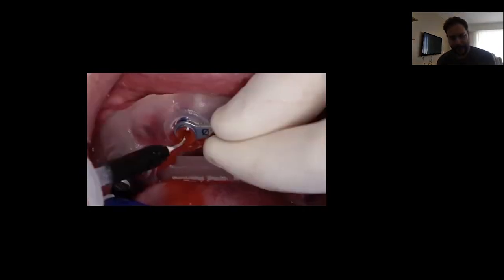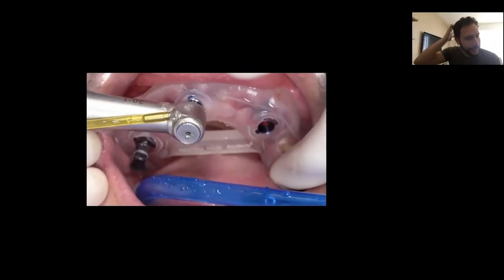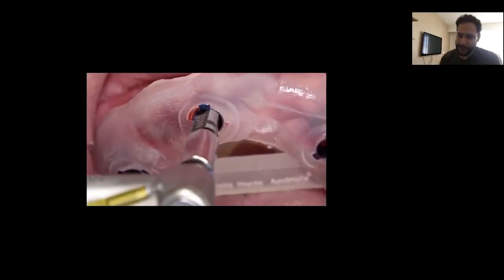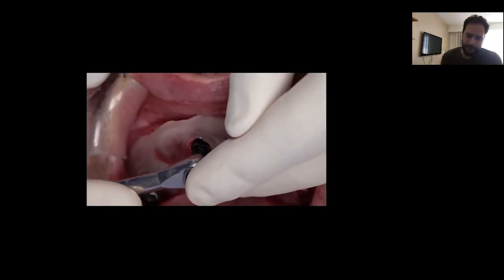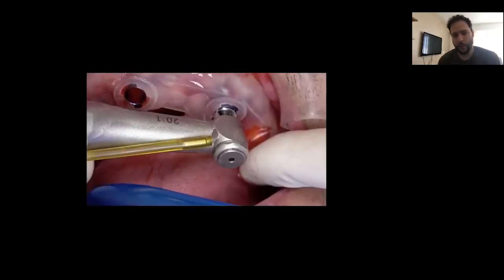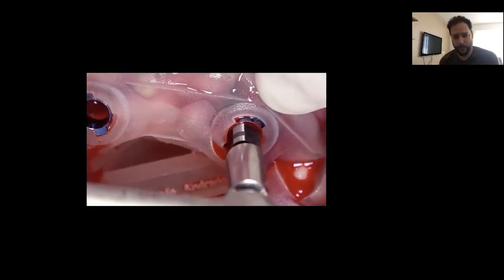Keeping the driver in place provides proper stabilization for the surgical guide. I then focus on all the remaining implant sites — again, not more than 50 rpm, not more than 10 seconds at a time, with plenty of saline irrigation between drills so we can achieve proper cooling of the bone.